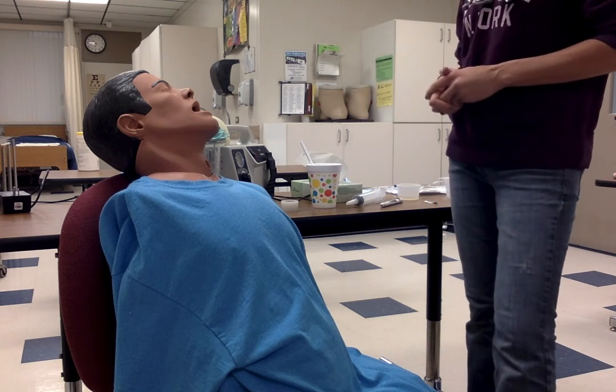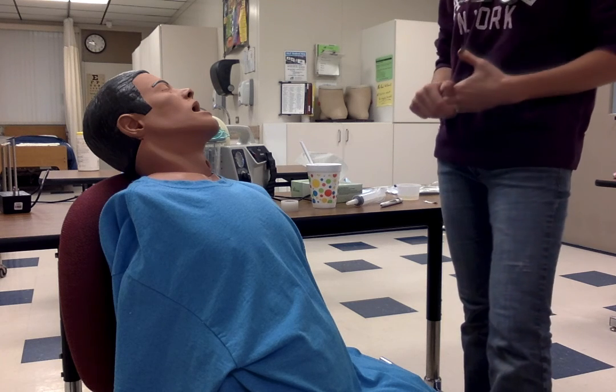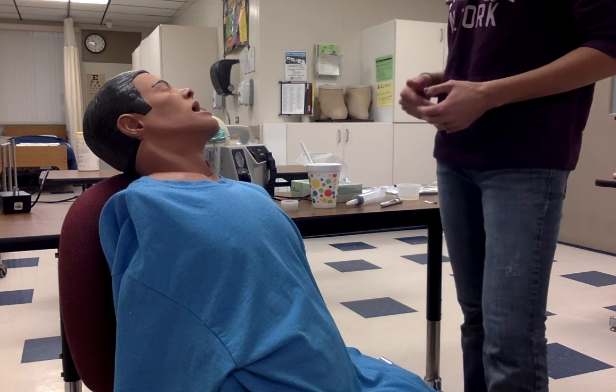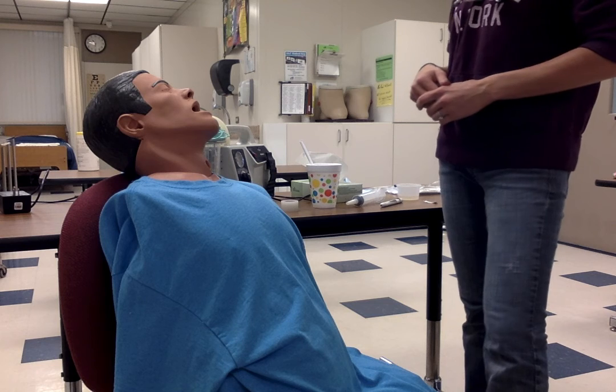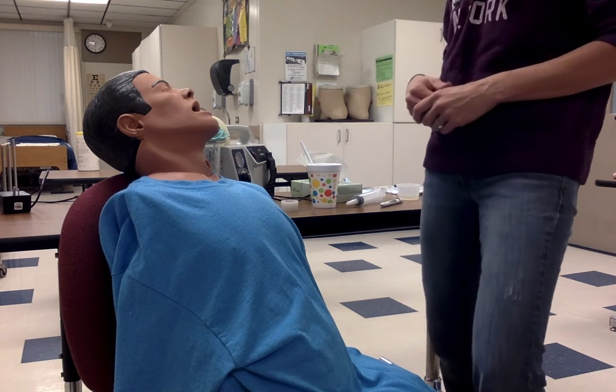So I would explain to my patient that what we can do for you is we can insert an NG tube, which they might not know what that is, but it's putting a tube into your nose. And we can do that to hopefully relieve some of the symptoms, the nausea and fullness that you're having.